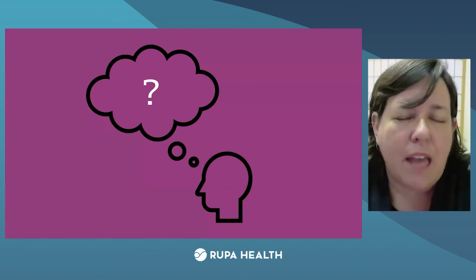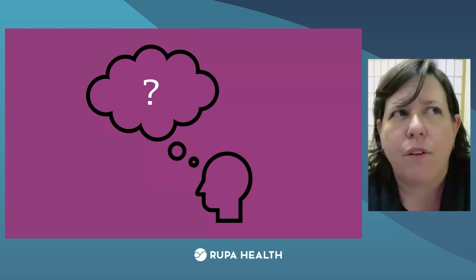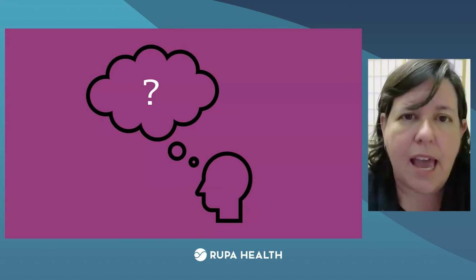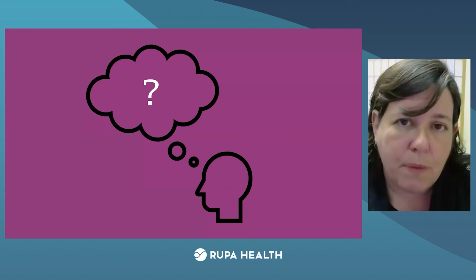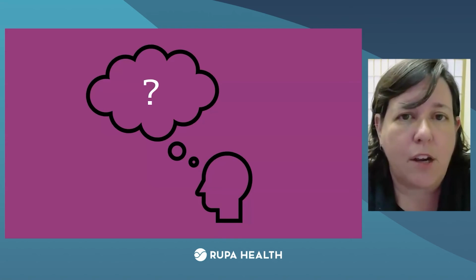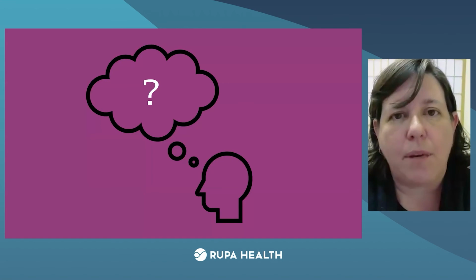Now, one thing that I've definitely found that is a big heads up, and this goes across all hormone testing in general, and it doesn't impact all of ours, some more than others, but just get in the habit, biotin. So a lot of patients with thyroid are on biotin. They're on hair and nails formulas. They're on high dose biotin for hair loss. Biotin is a problem for hormone testing. Now, it isn't as much of a problem for ZRT, for our LCMS tests or our saliva testing, but just get in the habit of not doing that.